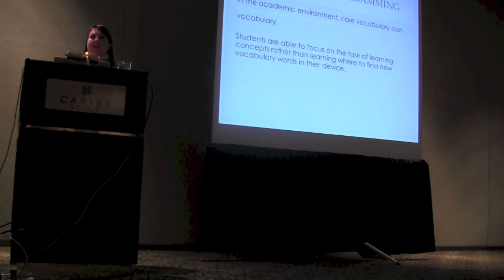So it's social studies class, and we're talking about the Revolutionary War. And so we say, okay, go to your social studies page. This is Revolutionary War, and this is a Tory, and this is a patriot. We're pointing out the vocabulary that we just programmed in that's not going to be useful next week when the theme and the unit change. So if we're using core vocabulary, we're modeling that a patriot was someone on our side, and a Tory was someone on the other side, right?